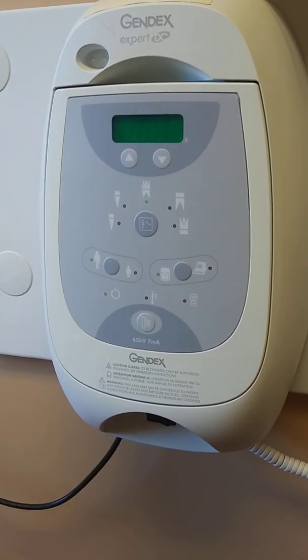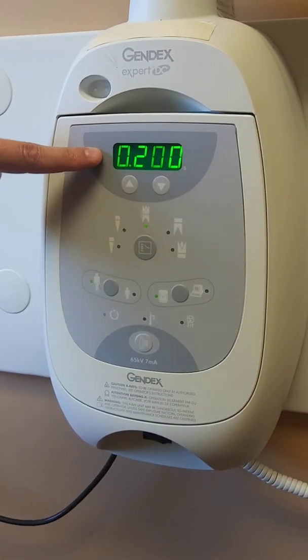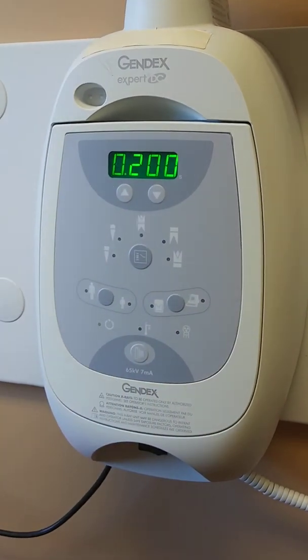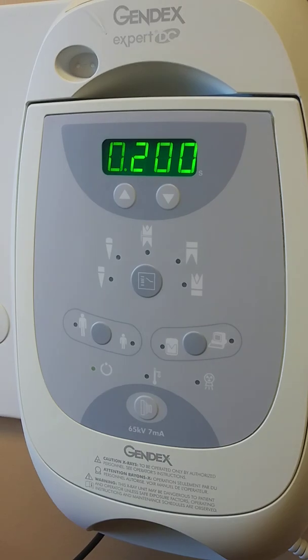Simply turn it on — there's always an on and off switch. You'll notice that the only digital component is right here, which reads out the exposure pulses for your KV. You have the adjustments where you can turn that up or down as needed. But you'll notice there are a couple other components here as well.